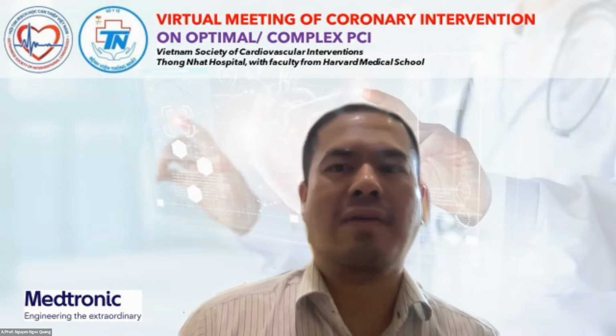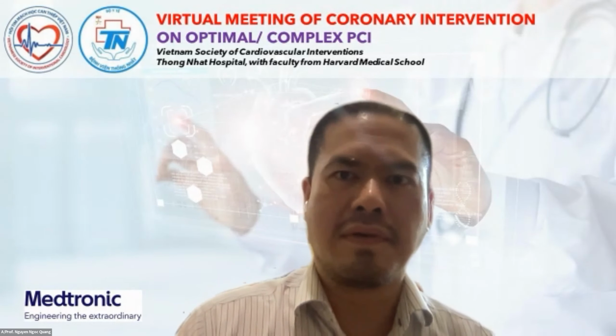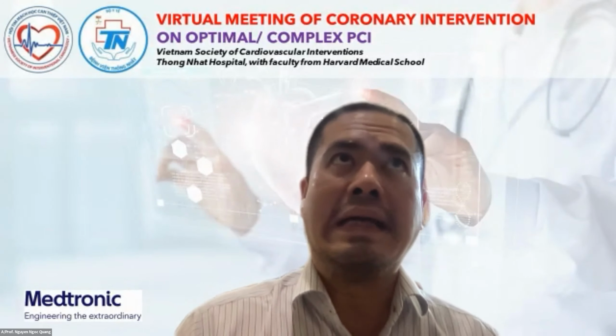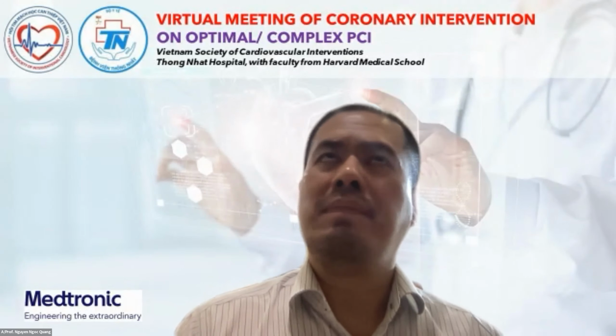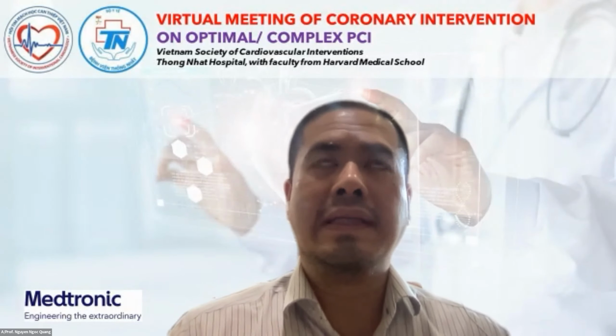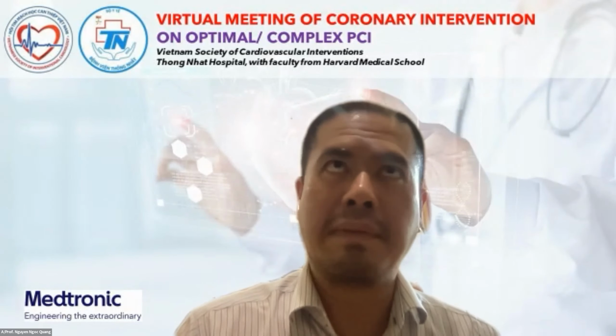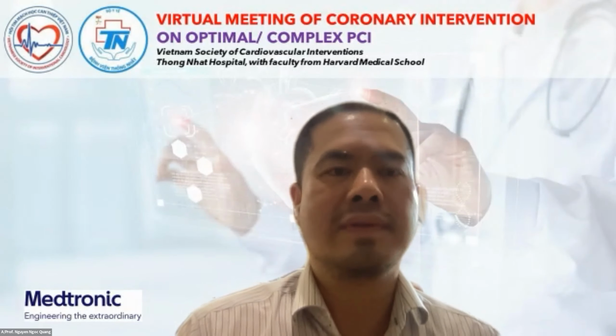So that is our recommendation for IABP, especially when the patient is undergoing high-risk PCI. If the patient came in with STEMI or in cardiogenic shock, then IABP is not much use.